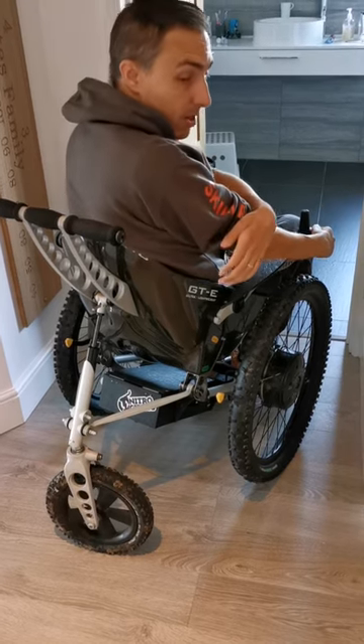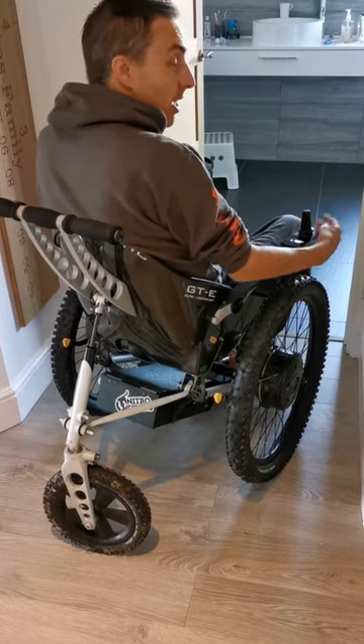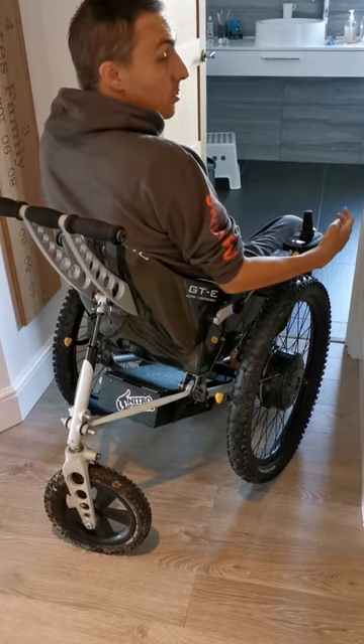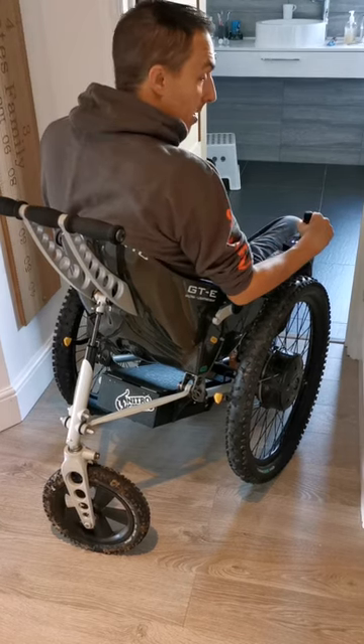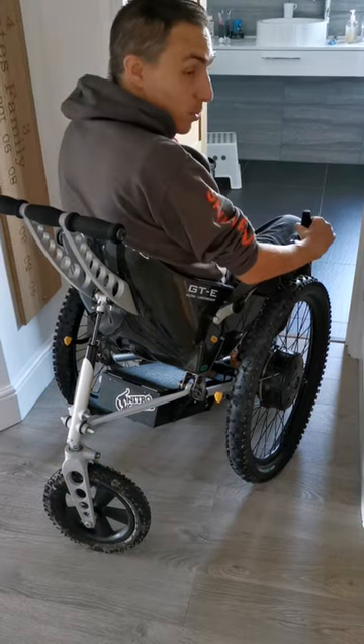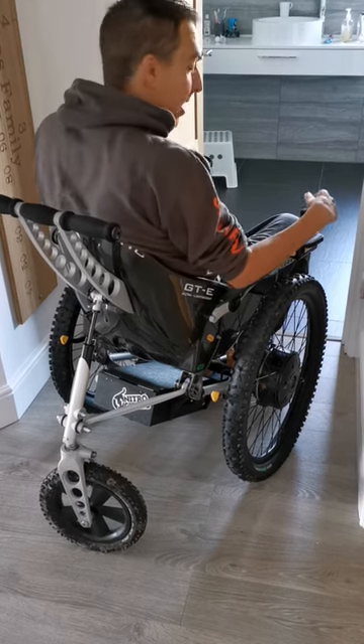Going backwards will make the castor on the rear wheel change direction and this will rock the chair slightly. It might mean that you lose control of your hand on the joystick, so just have that in mind. Going backwards in a hallway — as you might be able to see, I've already chewed the walls a little bit, but we'll try and avoid that today.